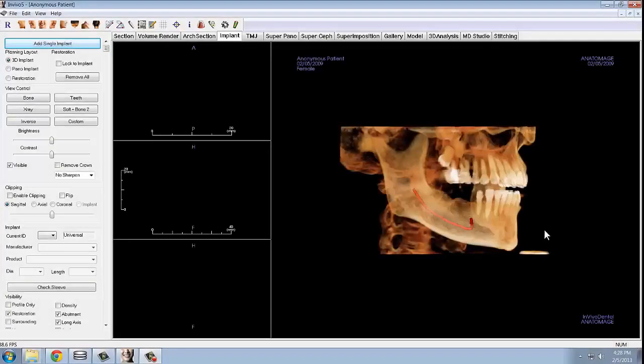If you are placing a single implant, it is easiest to use the Add Single Implant button. If you are placing multiple implants, it is easiest to use the Pano Implant view. First we will start with how to plan out a single implant case.